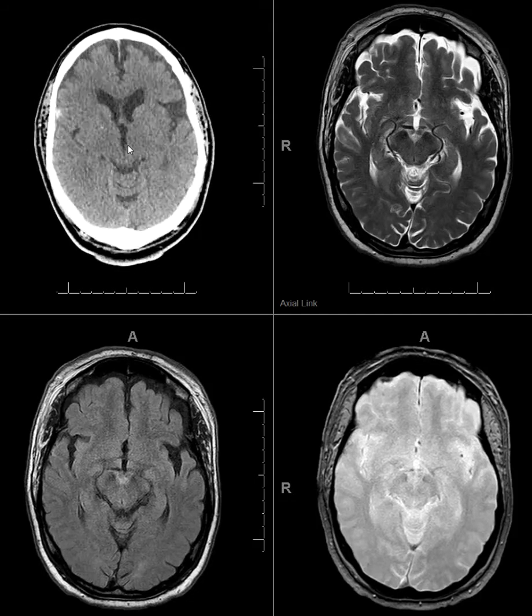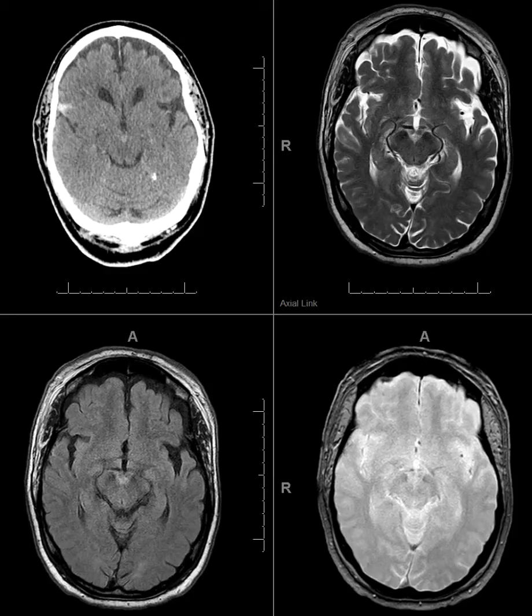What I'm trying to show here is the original report was called for subarachnoid hemorrhage and increased density in the region of the basilar artery tip. So aneurysm or focal hemorrhage are possible. So MRI was ordered, and I'm reading the MRI.